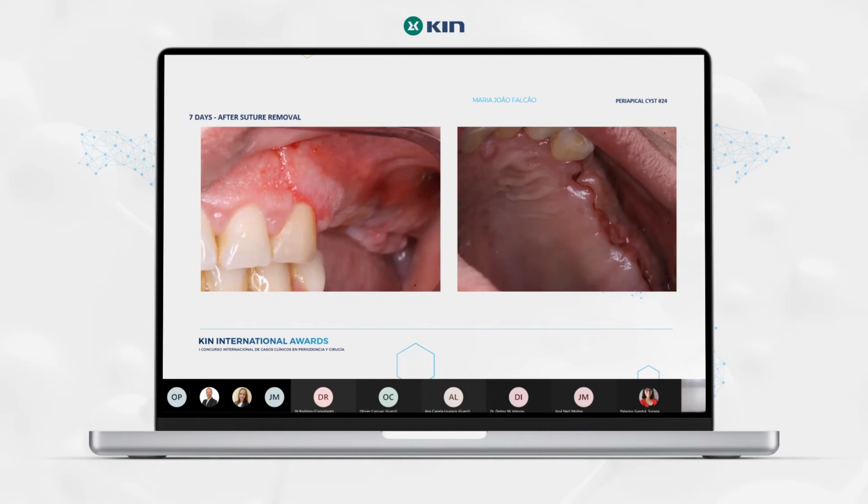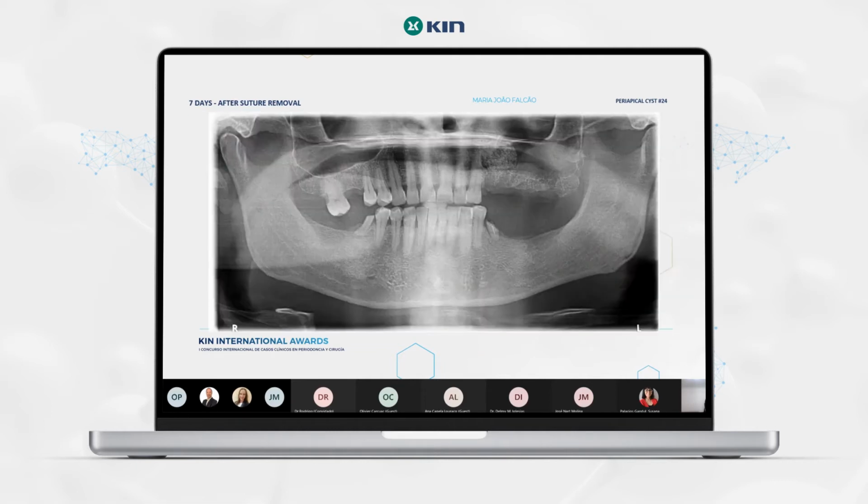So this is the healing aspect after 7 days. As you can see, it's quite good. We still have a little bit of inflammation. It's normal in the incisions mostly. So that's good. We did a new X-ray. You can check here. We have the space completely filled with the bone.